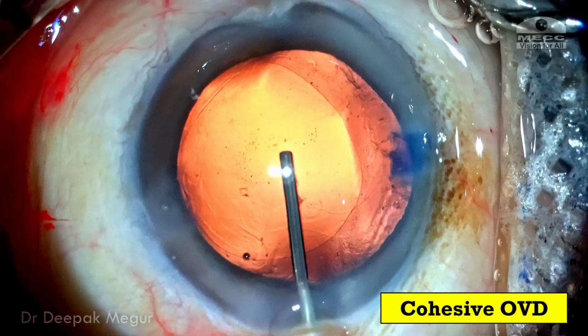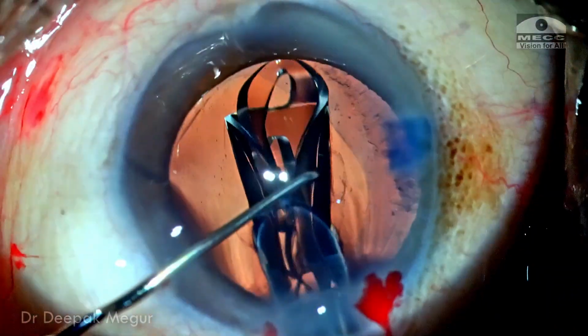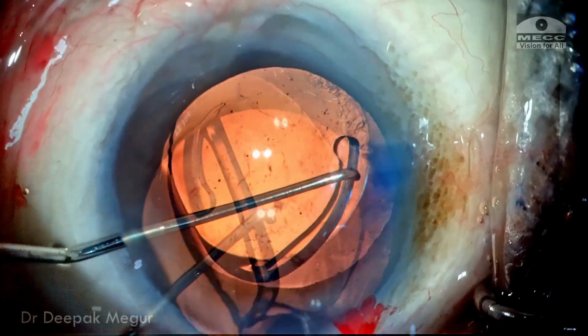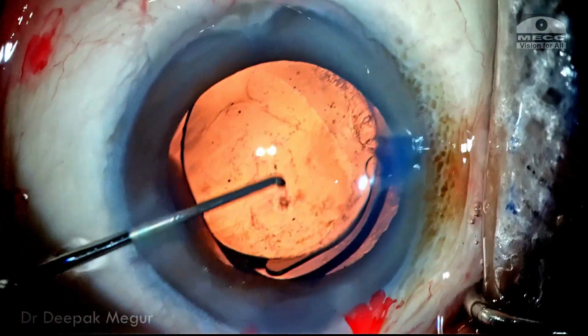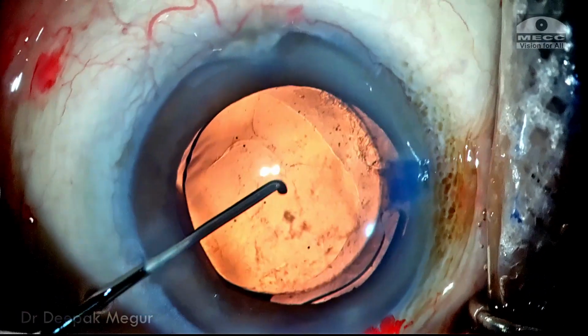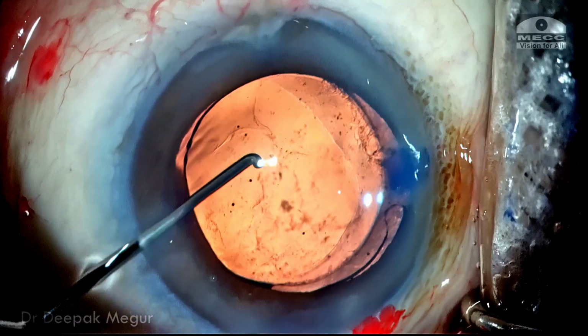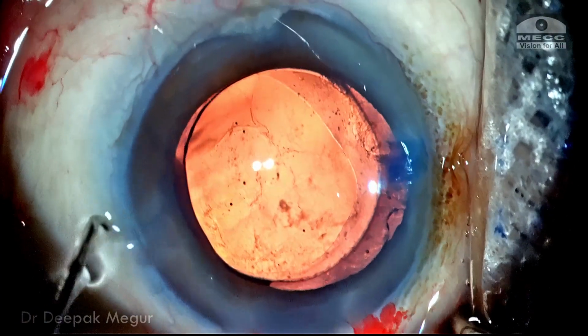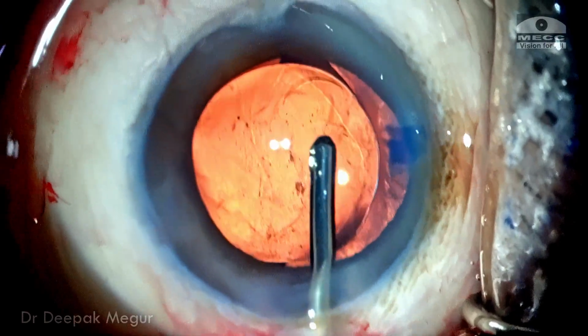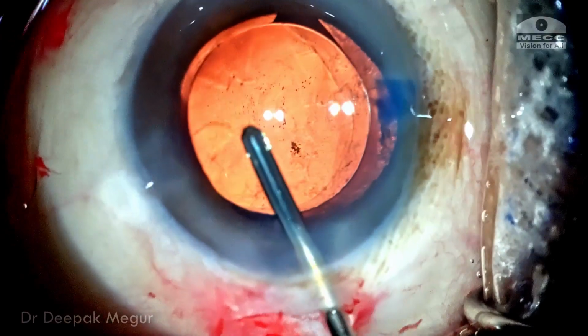The bag is inflated well with OVD and the originally planned single piece lens is being implanted into the bag. The rhexis looks eccentric, but that is because of the zonular weakness. The shape has changed once the CTR has been put. Now the OVD is being removed both in front of the lens and behind the lens. Care is taken to decrease the infusion pressure.